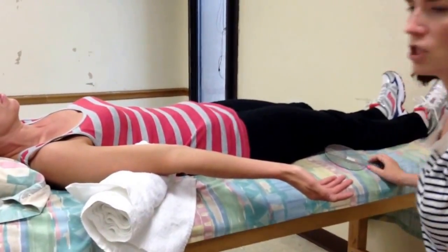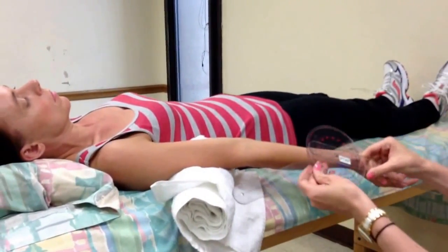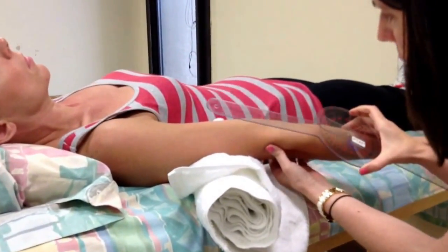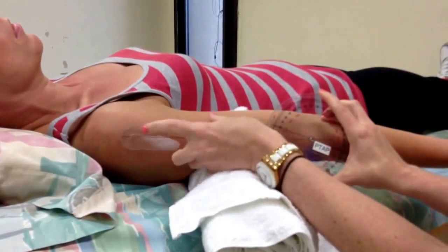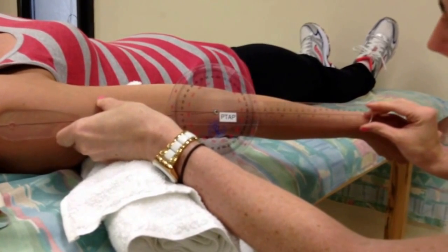Our goniometer fulcrum is going to be over the lateral epicondyle of the humerus. Our stationary arm is in line with the acromion process, and our moving arm is in line with the radial styloid process.